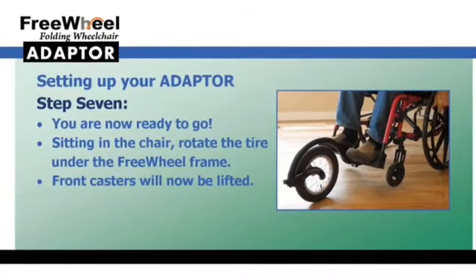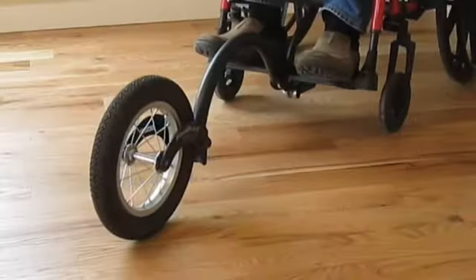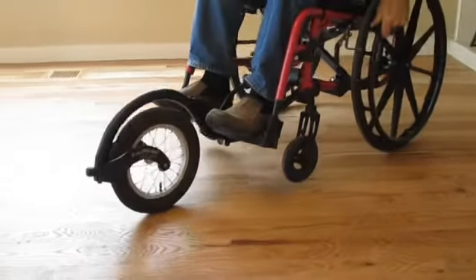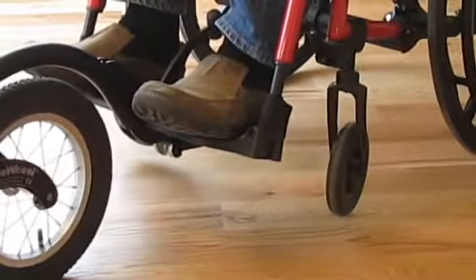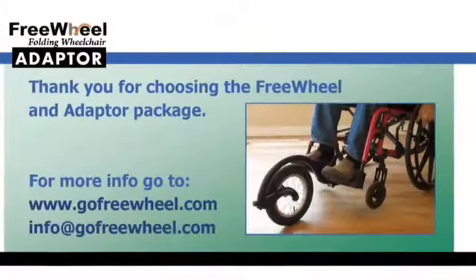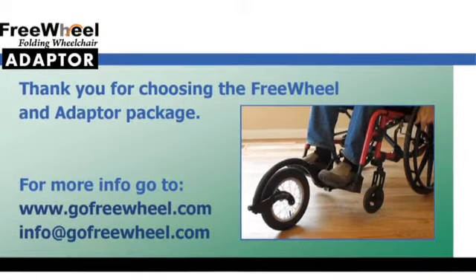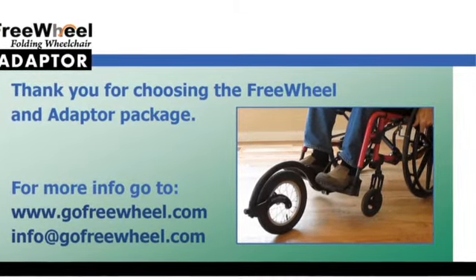This is the final step in setting up your adapter. Sit in your wheelchair and rotate the tire under the FreeWheel frame. The front casters will now be lifted off the ground. Always start in the tail-dragger position when you put on or take off the FreeWheel. You are now ready to go. Thank you again for choosing the FreeWheel and the folding chair adapter. Now get out there and get freewheeling.